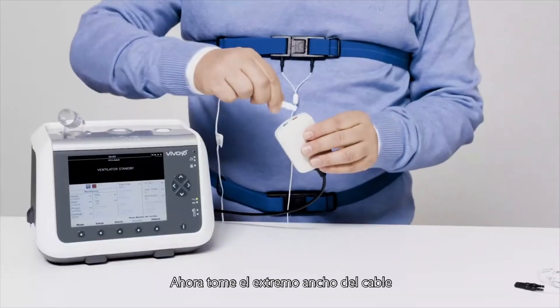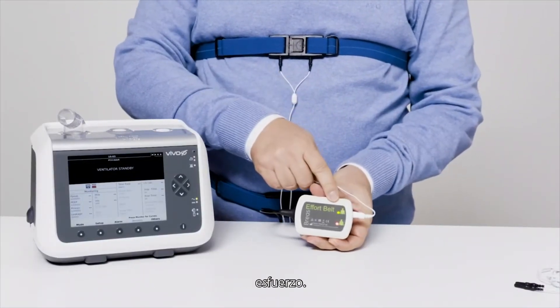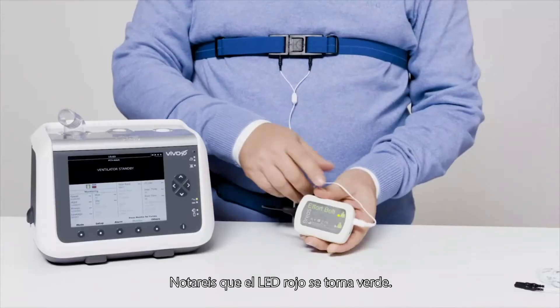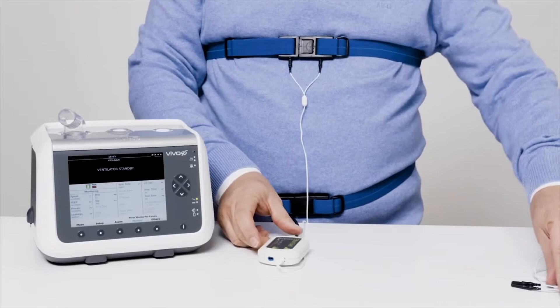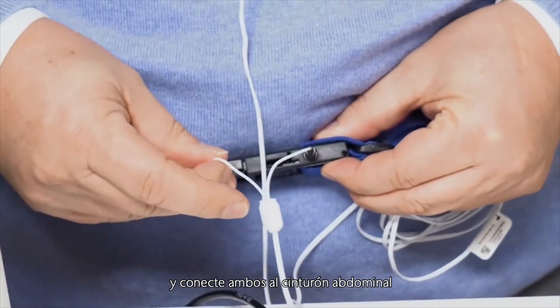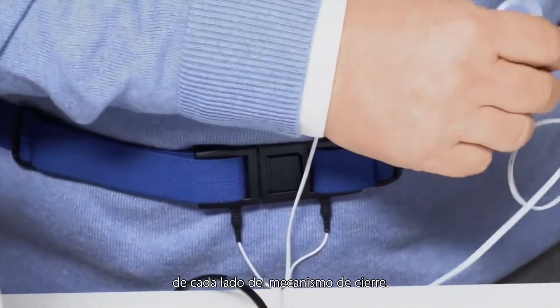Now take the white end of the wire and connect it to the red connector of the effort belt box.